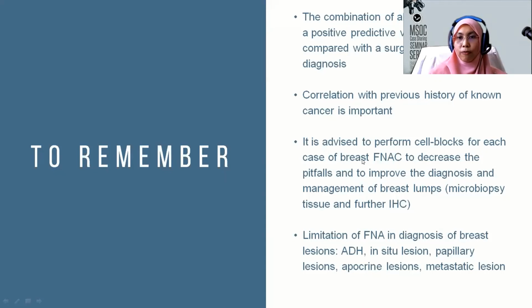It is advised to perform cell block for each case of breast FNA to decrease the pitfalls and to improve the diagnosis and management of the breast lump. So sometimes in the cell block, we can see microbiopsy tissue, and further immunohistochemical study can be done. Just remember, FNA cytology has limitations in the diagnosis of breast lesions. They include atypical ductal hyperplasia, in situ lesions, papillary lesions, apocrine lesions, or even metastatic lesions.